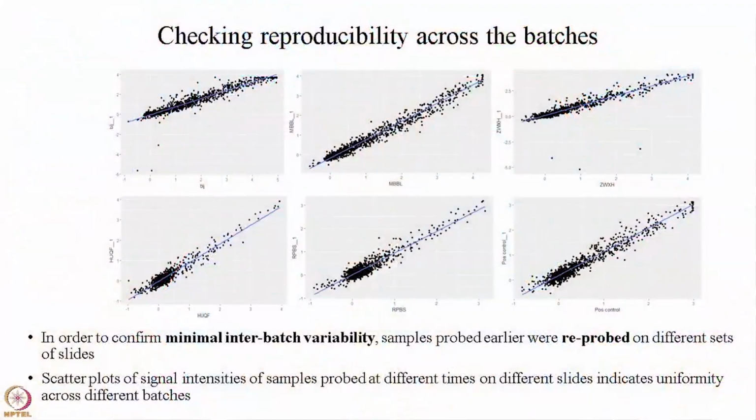Don't get confused between positive control samples and positive control spots. They're totally different. These positive control samples, I've excluded them from this particular analysis. We also had healthy controls, which are basically malaria naive individuals, meaning patients who were not detected with malaria at the time of admission. So they were malaria negative. Those patients were also taken and probed on the chip just to see if there is a difference in response. Such patients have also been removed from the analysis.